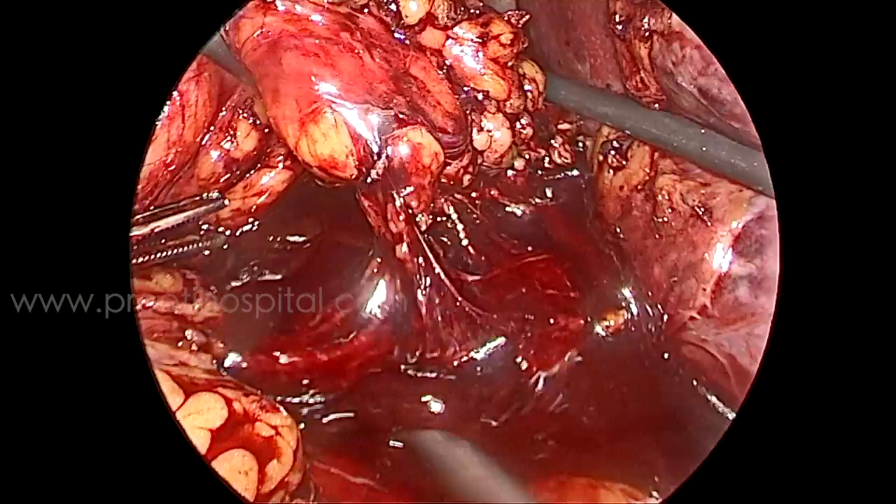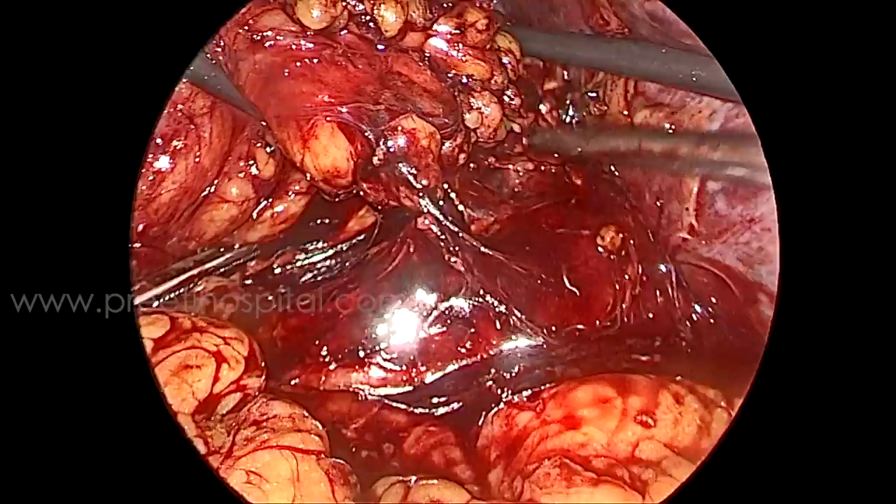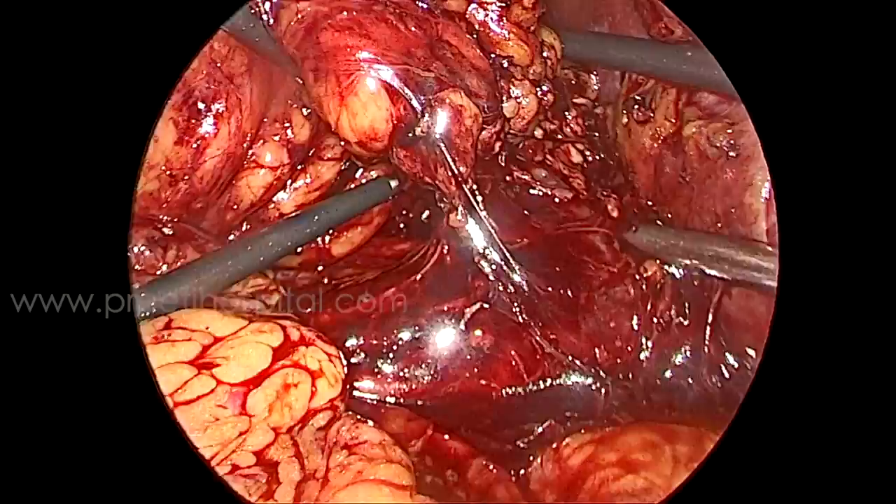Now suck out all the fluid, wait for some time, and raise the intra-abdominal pressure a little. Take a breathing time, alert the anesthetist, and think about whether we can proceed with partial nephrectomy or not. A very big vein was there by the side — a big vein of similar size.